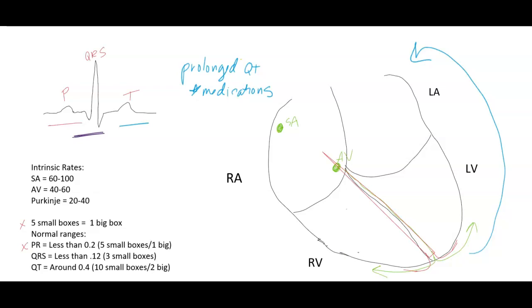If we go back and we think of that prolonged QT, or the T wave, so to speak, being the restart of the heart, if it's taking too long for that heart to restart, if you can envision, you could have something starting from anywhere if the process is going too slow. So what happens here with prolonged QT is you can actually have the heart almost trip itself up, and it may go into a lethal arrhythmia. So prolonged QT, we do need to care about that.